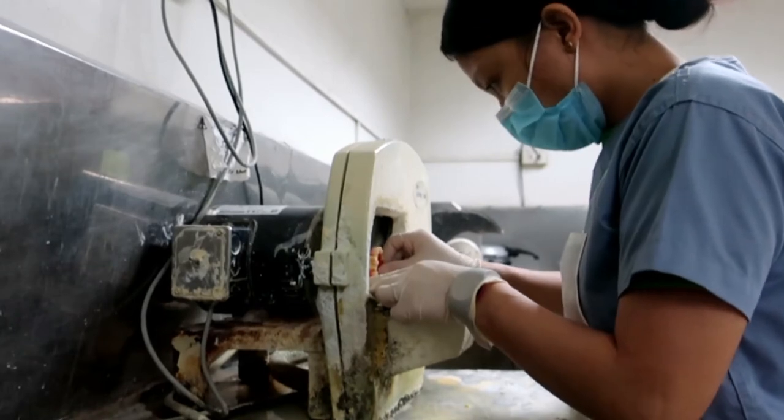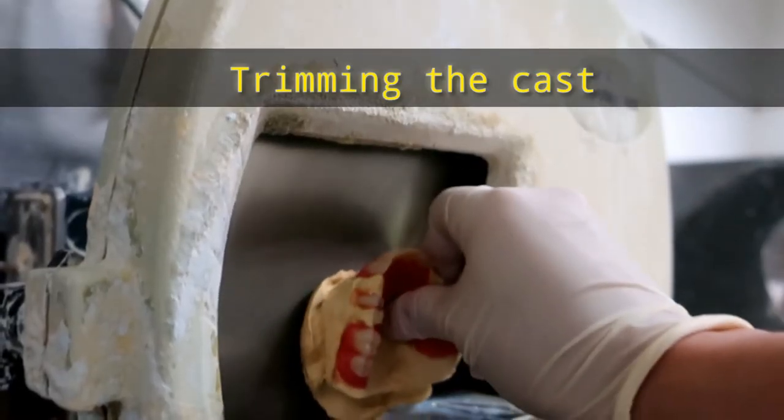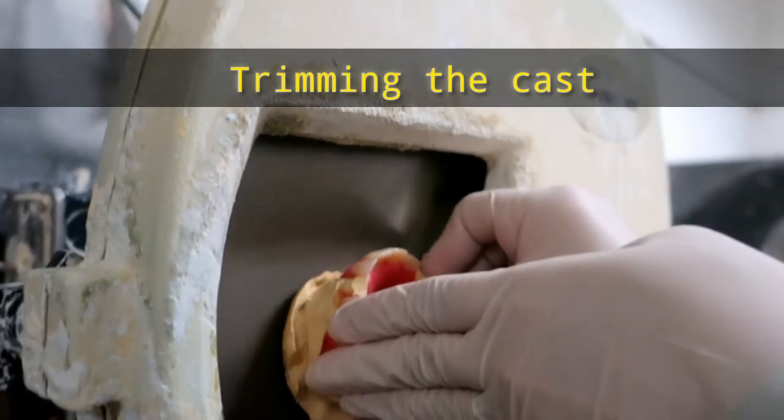Now let's go for the trimming. The occlusal plane should be parallel to the countertop.